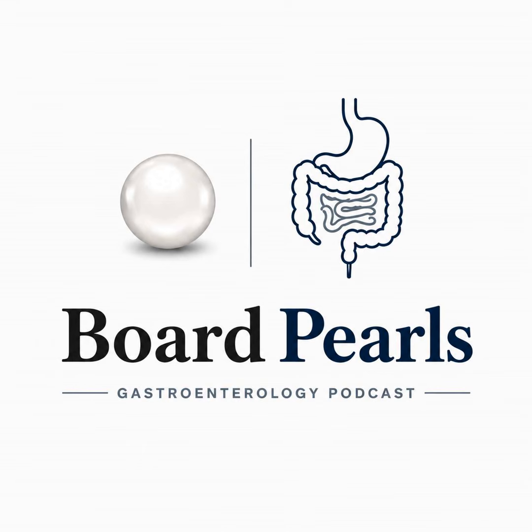The logic is straightforward. If the Patency capsule passes intact within the 30-hour window, the gut is patent enough for the diagnostic capsule and the diagnostic study can proceed. If it does not pass, or it partially dissolves in fragments, the patient has a stricture tight enough to retain a capsule. The diagnostic study is then deferred or delivered endoscopically into the duodenum with arrangements for retrieval if needed. The Patency capsule does not eliminate retention risk in Crohn's patients, but it dramatically reduces it.